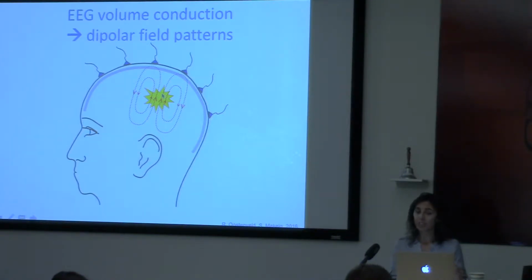So these can be represented by point-like sources inside the brain, and that would give us recordable EEG measurements. And although the axons have some length, and actually they are line sources, however, the length of the axon is infinitesimally small compared to the distance between the source and the EEG electrodes.